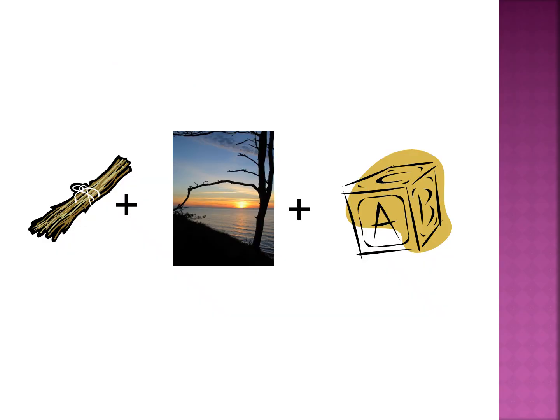So the next thing we want to talk about is, can anybody guess? Bundle branch blocks. I know, cute, isn't it?